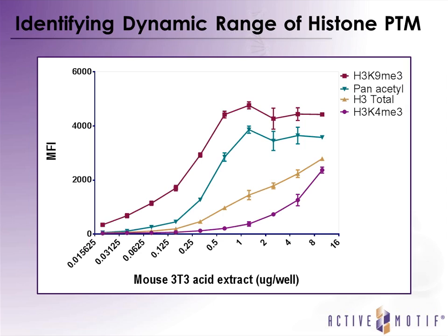When setting up an assay, we recommend that you start with a 2-fold dilution series of the lysate using the bead multiplex of interest as a means of gauging how much lysate to use. Here we see data for 4 of the bead sets from the same experiment as was shown in the previous slide to show how bead signal intensity varies with the lysate amount.